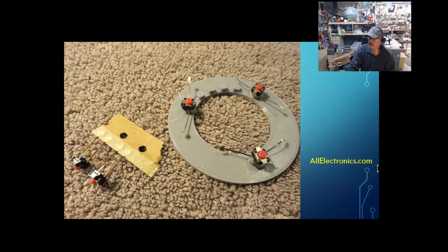And now, these switches I got from allelectronics.com. These are these printed circuit board switches I talked about, and they're just hot glued on. Now what I did, I took these two legs here off the strip, and I cut off this little mounting tab on one side, since it wasn't going to quite fit here. It's no big deal, just cut it off, and I just bent the wires out to the side.